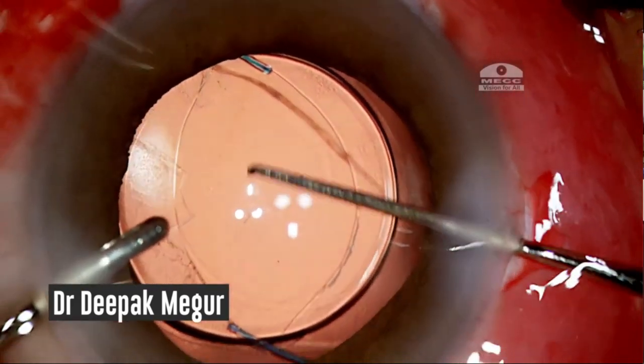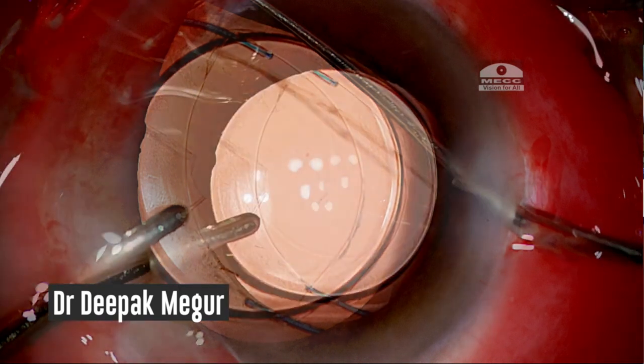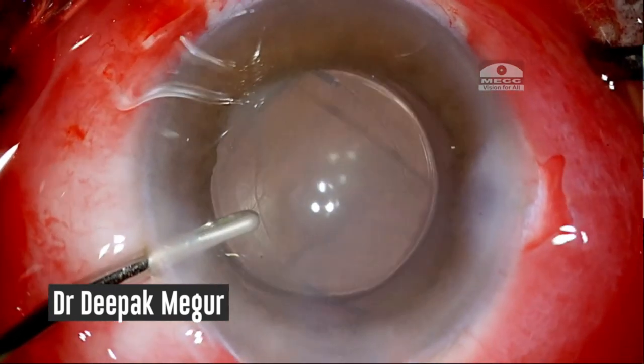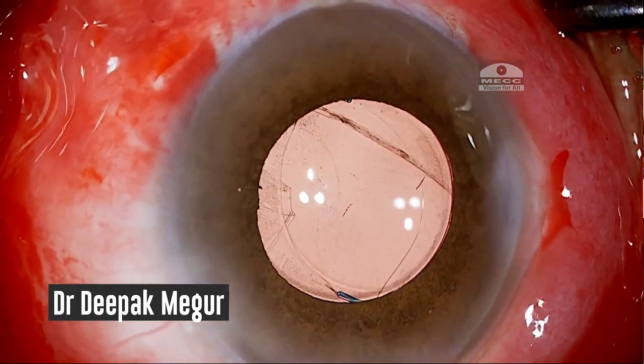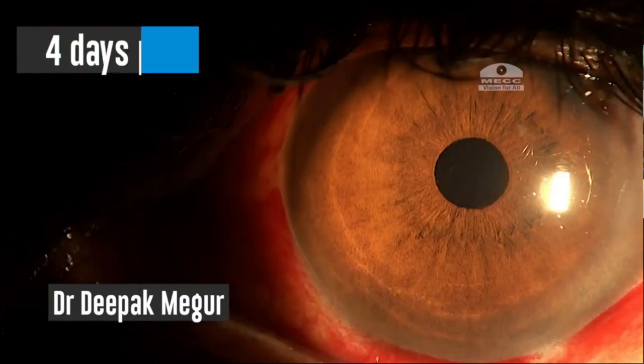Once the OVD behind the lens is removed, now is the time to achieve the optic capture. With the irrigating handpiece in my left hand, I gently nudge the optic behind the rhexis margin using a lens dialer. The rhexis becomes oval. The ovalization of the rhexis is an indicator of the perfect optic capture, which has been achieved with the haptics being in the sulcus and the optic behind the rhexis margin.